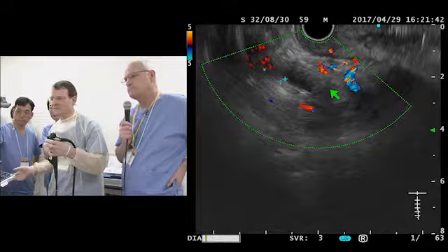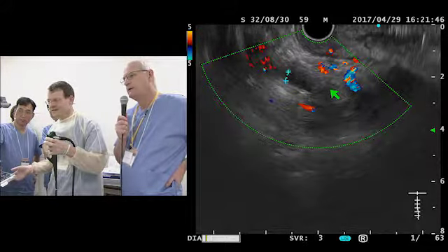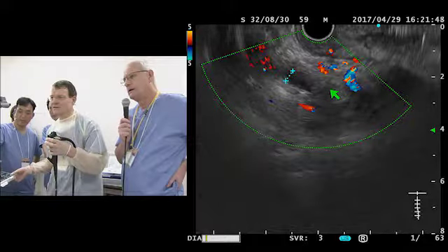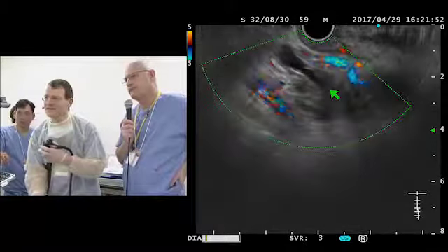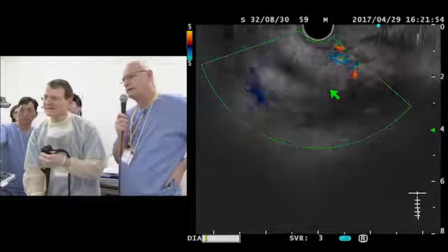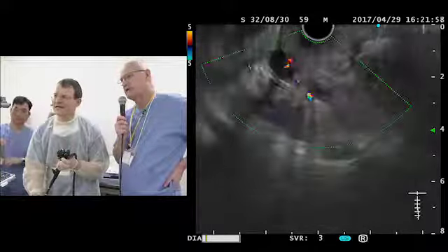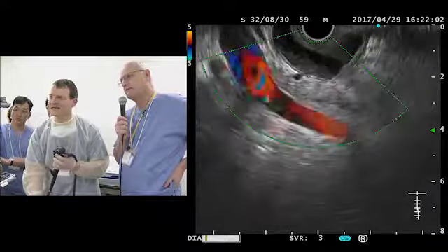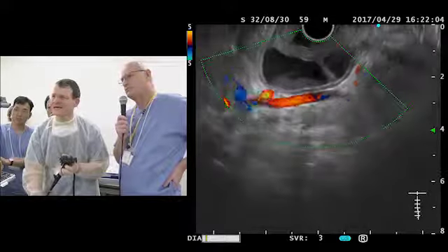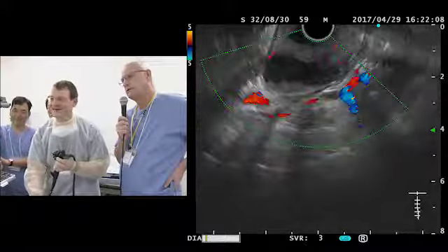We will measure this. Okay. The bile duct should have some layers to it. Yes. I'm not so sure. And this may be a cystic lesion in the pancreas. Yes, because the abnormal structure there is quite irregular, so I would agree with Norio. That's probably part of that cystic area. Yep, we see the portal vein, but I'm not sure what that is. It's like an intramural cystic lesion. We had this already today in the other case.